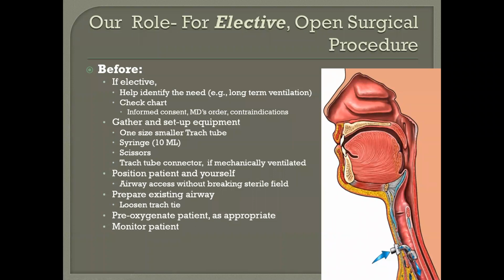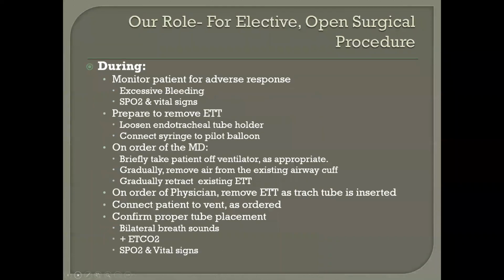It's okay to be delayed a moment, but if you're still fiddling around with that, they're going to stare at you and be like, have you done this before? Did you stay at a Holiday Inn Express last night? What's the deal? So really be thinking ahead about what's actually involved in assisting with it and be as ready as possible. And obviously, monitoring your patient.